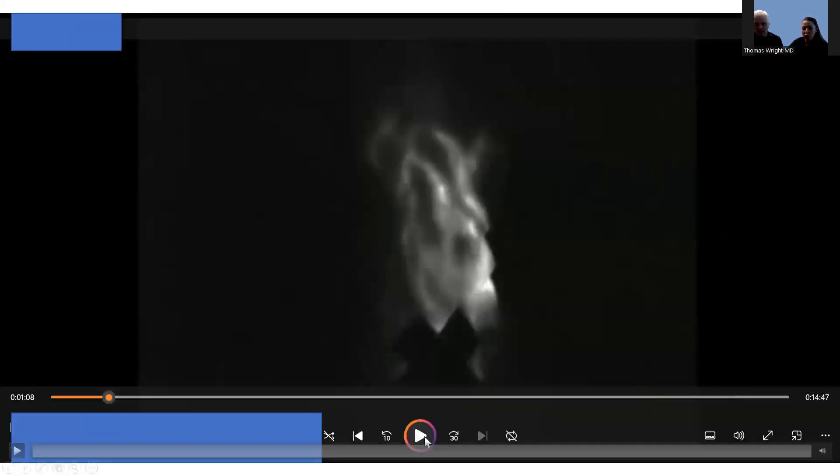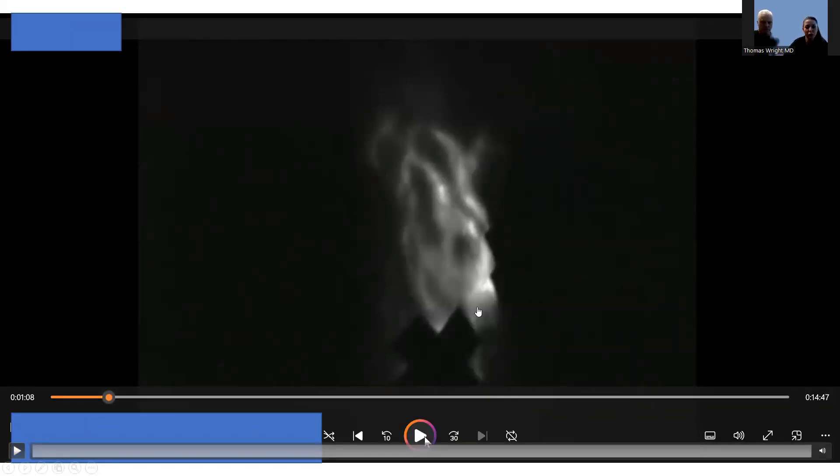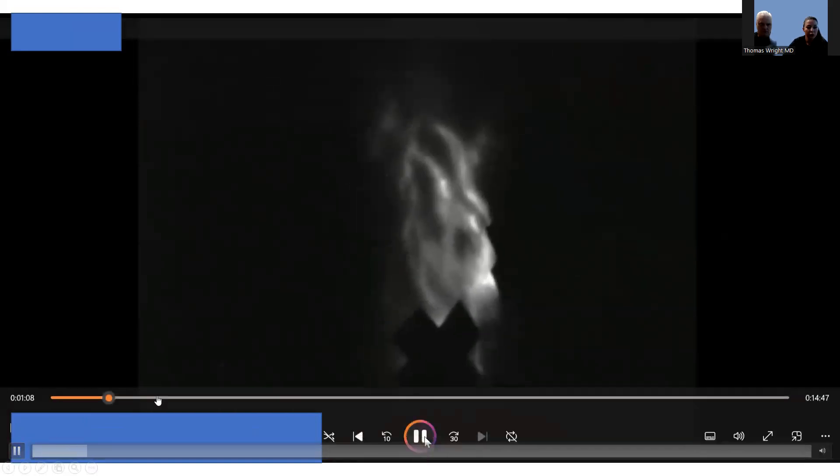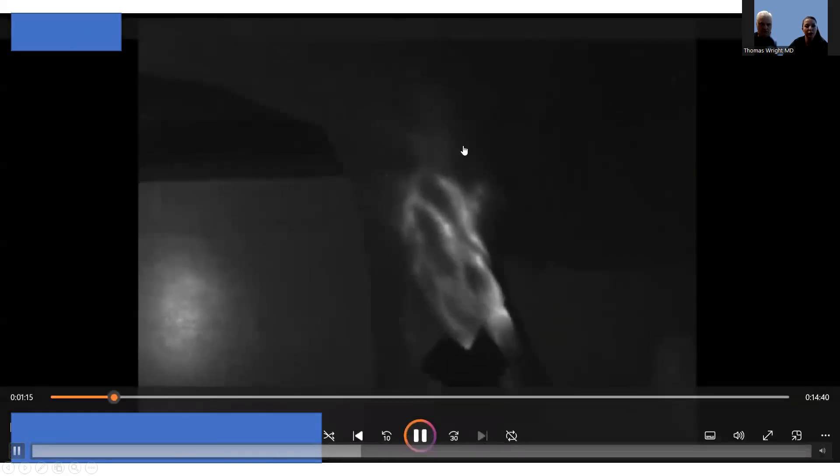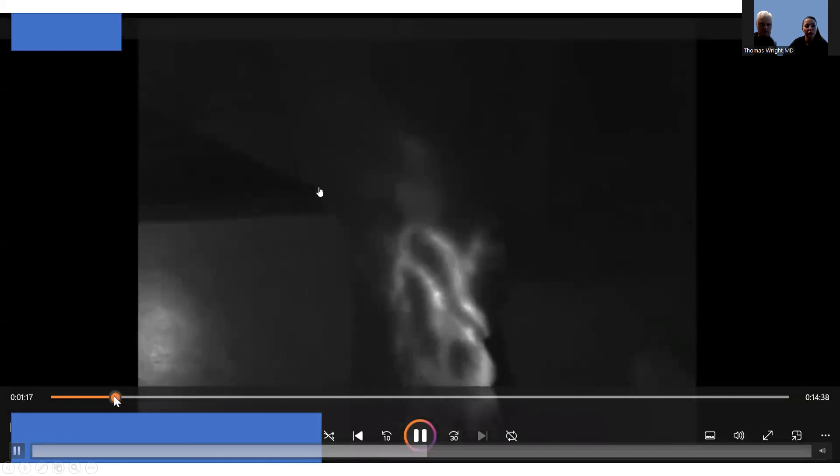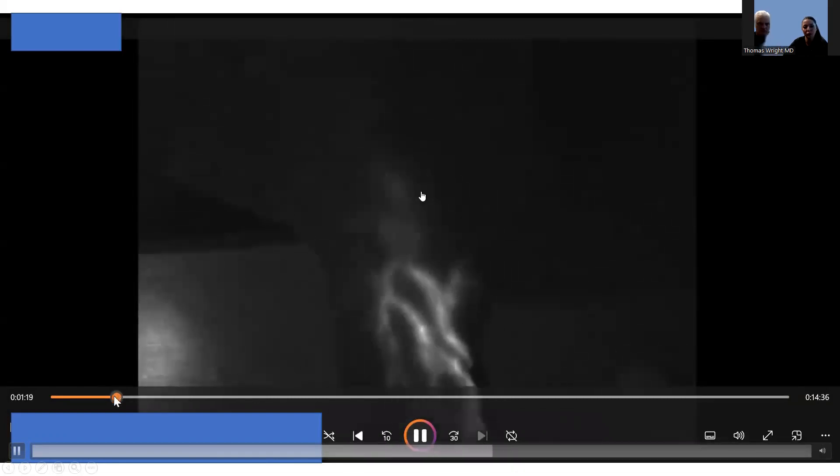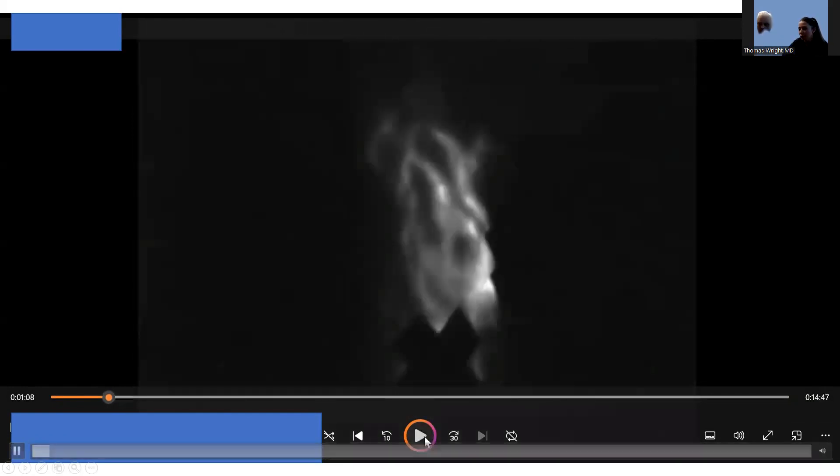The next patient I'm going to show you, this was the one that I had shown you in that very first video where we were first injecting her feet. You can see these X's over her foot. This is the top of her foot right here. And then you can see very clearly as you image up the leg here, this is that calf. There's almost no flow that you can see clearly until some diffused pooling right up that interior aspect of that calf there.